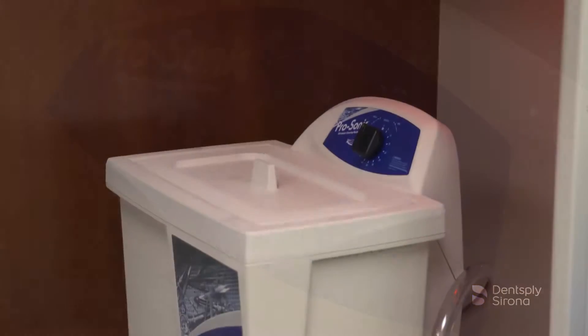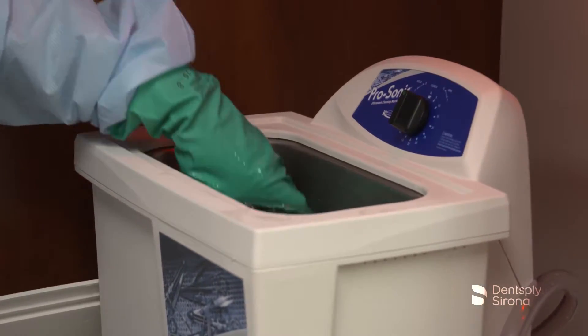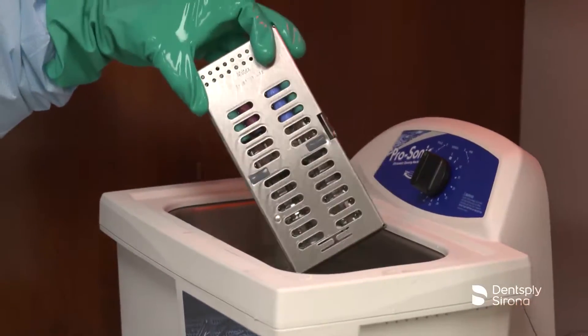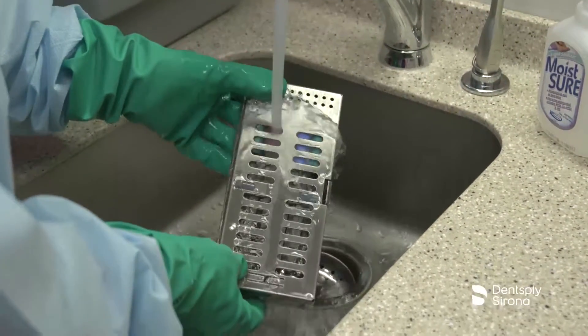After the allotted time in the ultrasonic bath, remove the instruments and rinse the inserts under running water for 30 seconds to remove the cleaning agent. A disposable syringe may be used to rinse the holes and cannulas of the Cavitron inserts.